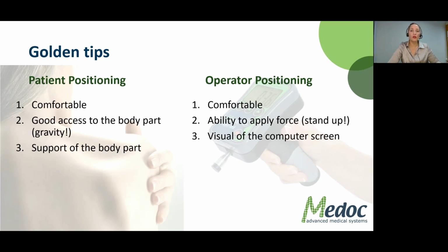I want you to have a visual of the computer screen, because the computer screen is giving us the feedback about how we are doing in applying the pressure at a steady rate and in a steady state. So you need to see the computer screen quite well when you're doing the testing. But I don't want the patient to see the computer screen, because if the patient sees the computer screen, they can be distracted. They will QA you. They will say, "Oh, this was messy. You didn't do this quite well," or they will, as all patients will try to be as consistent as possible.